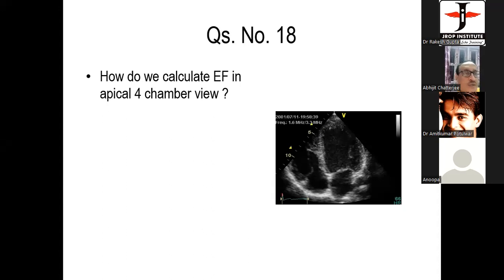Ventricle, diastole. Systole, when the atrium is largest. And from where to where do you measure? Now think before you answer. From where do you start?